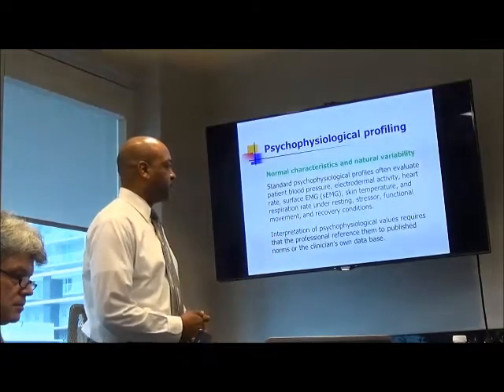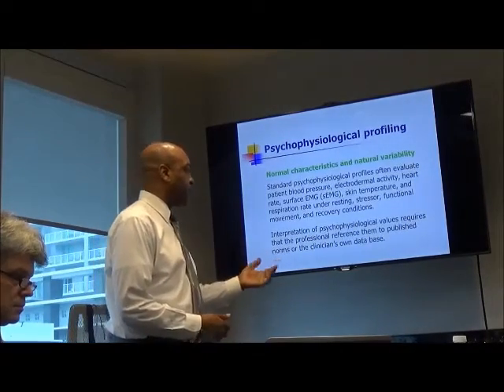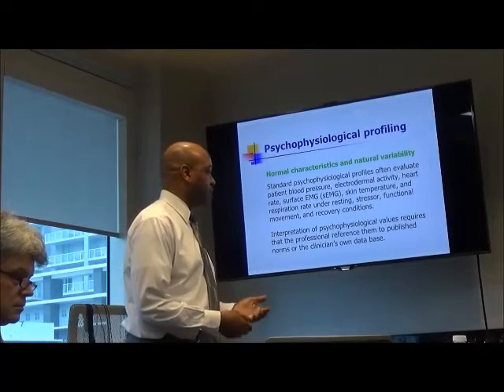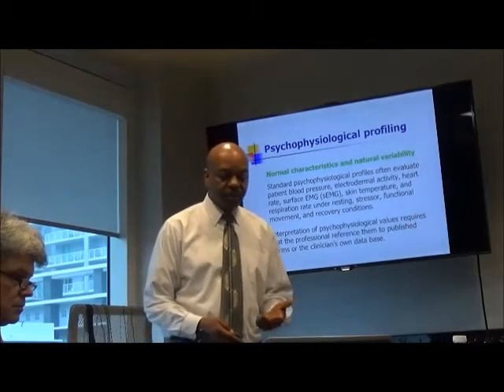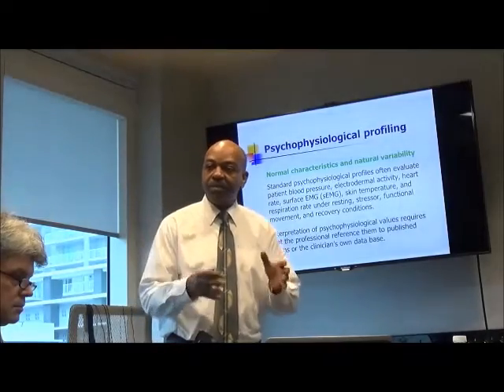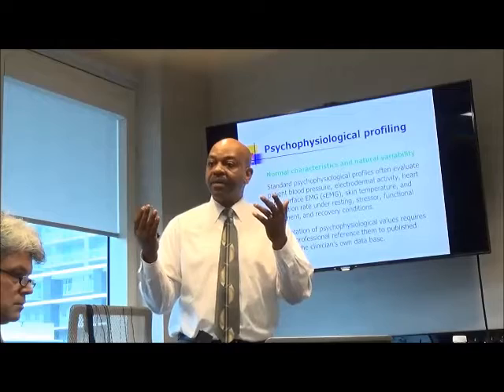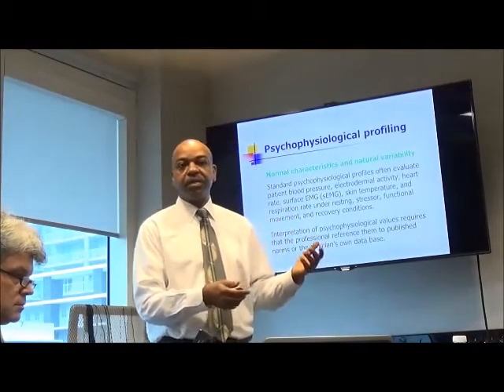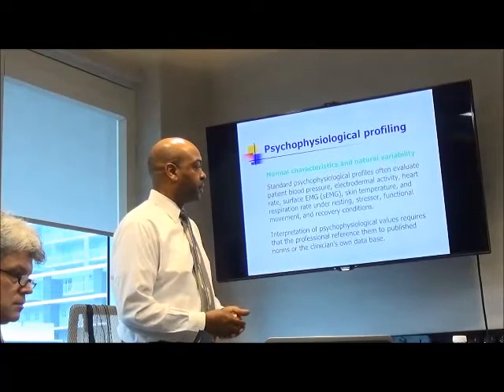So the interpretation of the values, it's saying requires that the professional reference published norms or your own database. So you're looking for whether the readings even in baseline are within what you would consider normal range, or maybe they're higher than what would be expected or lower than what would be expected. And then also what happens under stress conditions and recovery conditions.